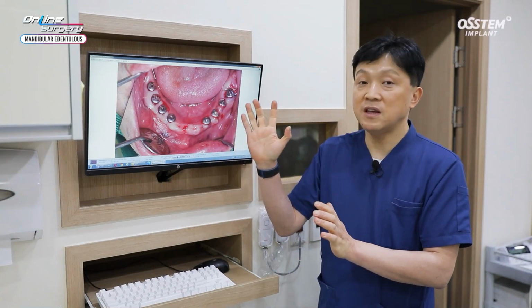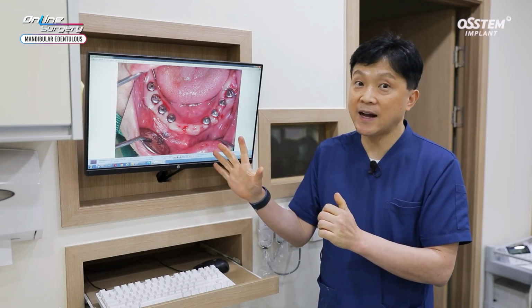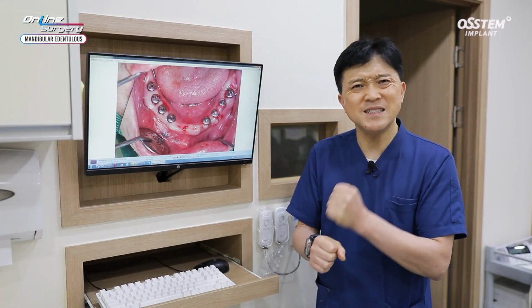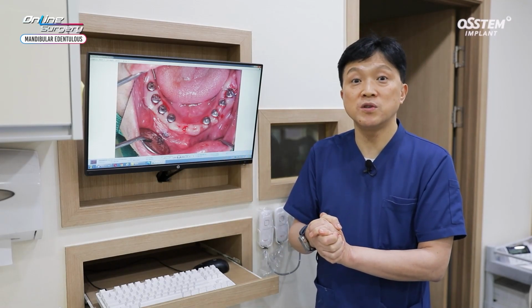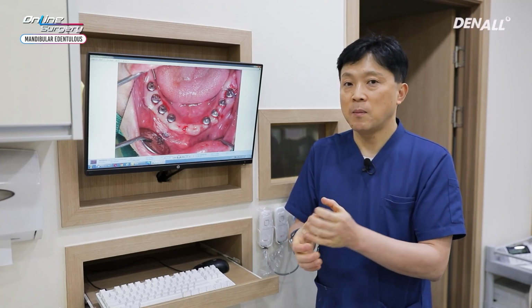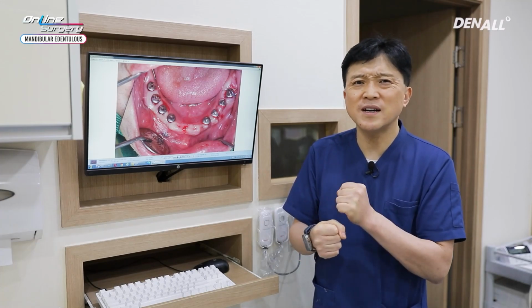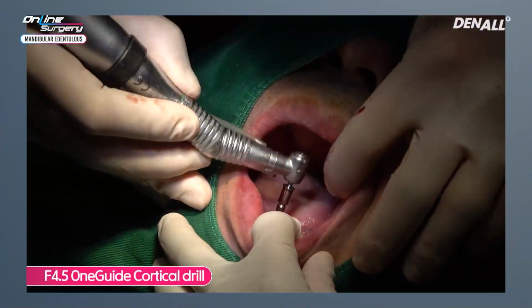In the case of placing implants in the lower right and left, at times there can be excessive insertion torque. In the case of mandible, at times, template and implant driver can get stuck. When you have fixated template using anchor screw, then it can be very difficult. But you can anticipate situations ahead. When you place implant using the engine, at times it can stop even though implant has not gone halfway through due to excessive torque. Don't just try to place the implant hand-driven all the way.